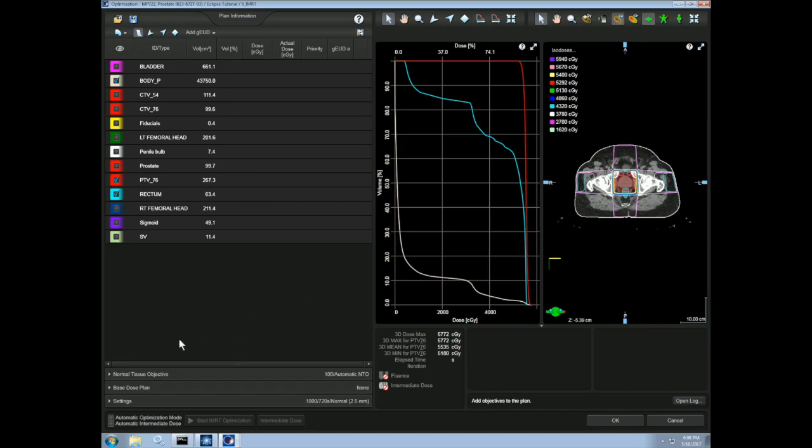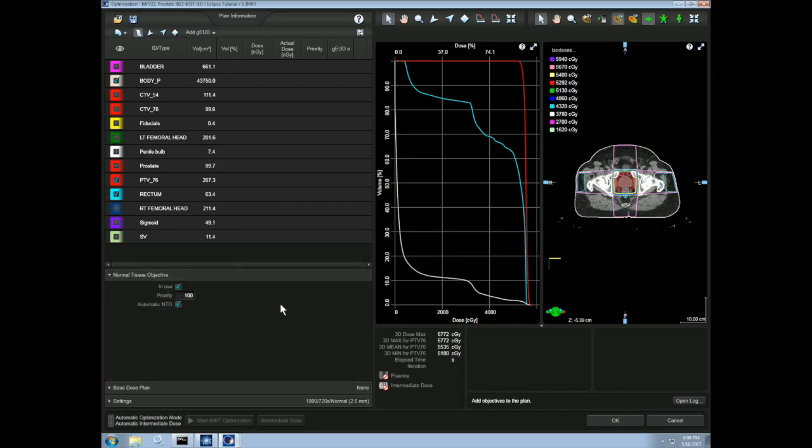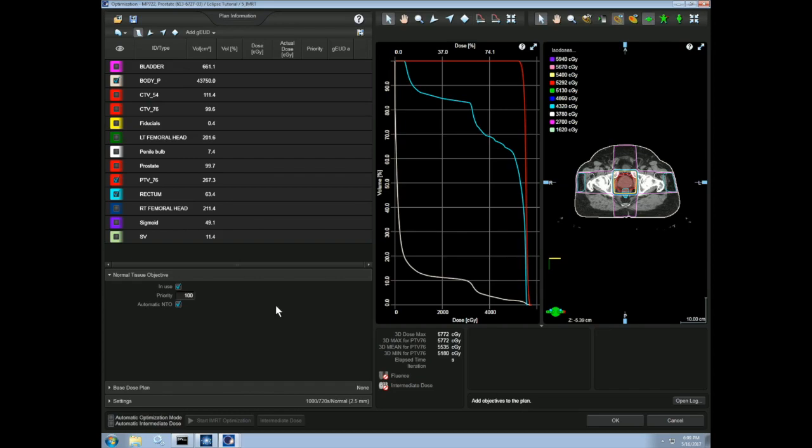When normal tissue objectives are in use, the optimization automatically tries to limit dose to all tissues within the body contour. This is one reason why the body contour is so important. This can be set to work automatically or use manually defined settings. The manual settings can be used to weight the normal tissue penalty as a function of distance from the PTV surface.